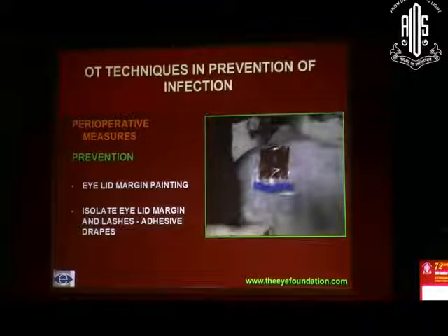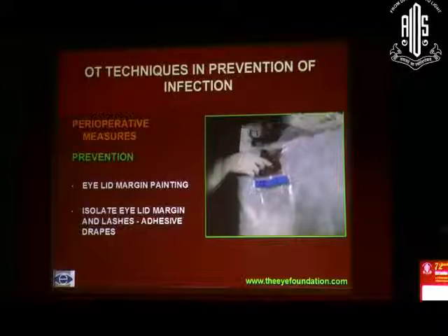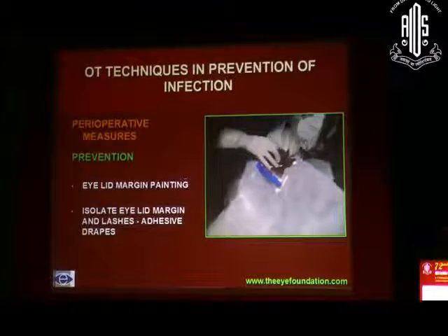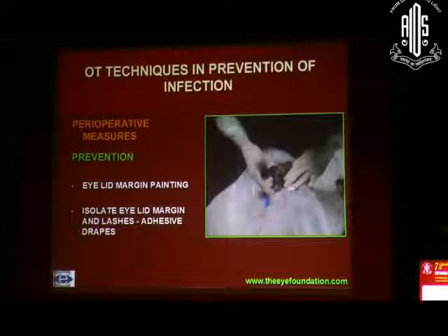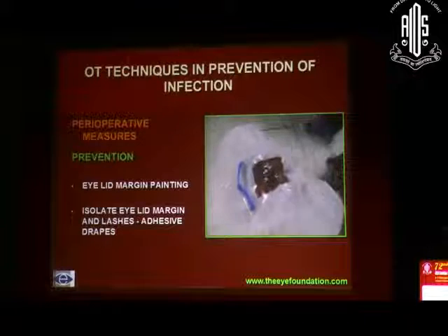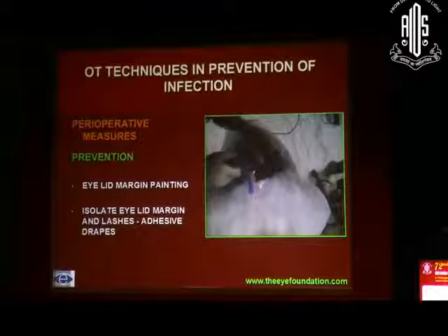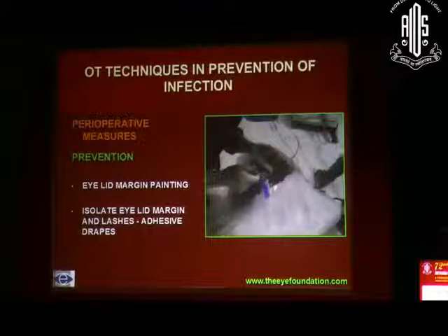So see that once you do that, you have to be careful so that you keep away the lashes. The problem is the bacteria are not at the tip of the lashes but at the base of the lashes. It is where they are there. So even though the tips are going to be in your operative field, it's more of a nuisance. For that sake, also you have to see that they are away from your surgical field.